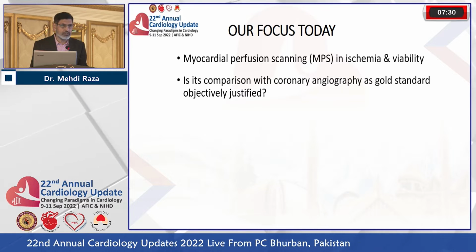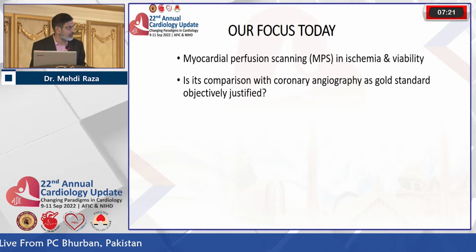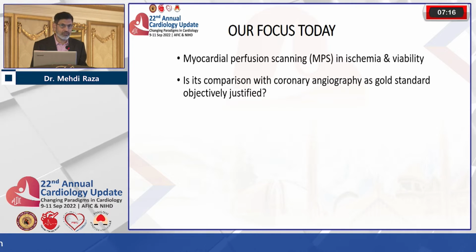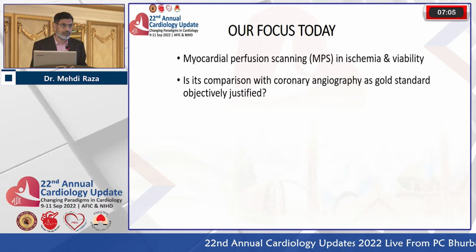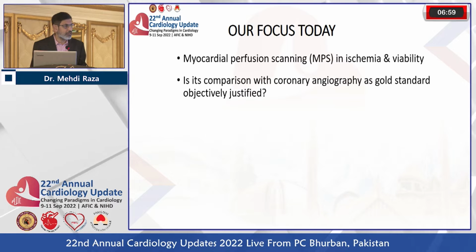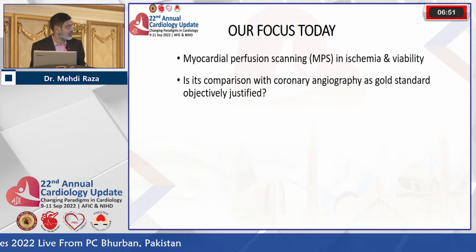Mostly, myocardial perfusion imaging is compared with the results of an angiogram, be it a CT angiogram or a conventional angiogram. The issue with this type of comparison is that it is only a visualization of the lumen of coronary vessels of the larger and medium size when we are doing an angiogram or a CT angiogram. But when we are actually doing a myocardial perfusion scan, we are looking at the perfusion of the myocardium itself, which is definitely not supplied directly by the larger or the medium sized vessels, but by much smaller arterioles and capillaries.